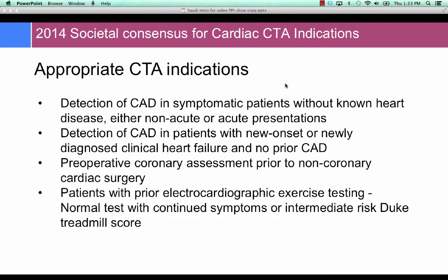That said, we now have guidelines for cardiac CTA, which have been developed over about the last 10 years, and these are guidelines that have been the results of both observational studies and randomized clinical trials. And we have about a dozen common indications, this being particularly important here where the payment for the services for treatment of coronary artery disease, interventionally particularly, is determined by the patient's insurance companies. So it's been necessary to develop strict guidelines of when a coronary CTA is clinically important and when it's not.